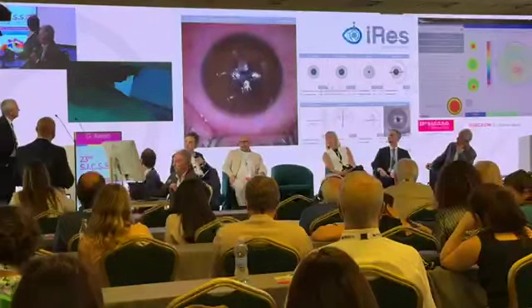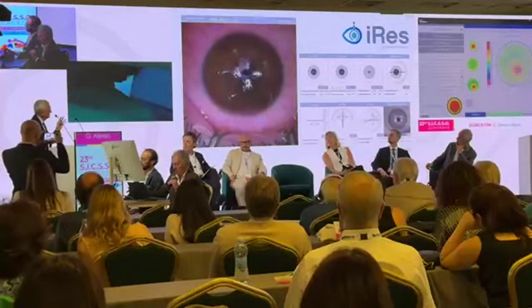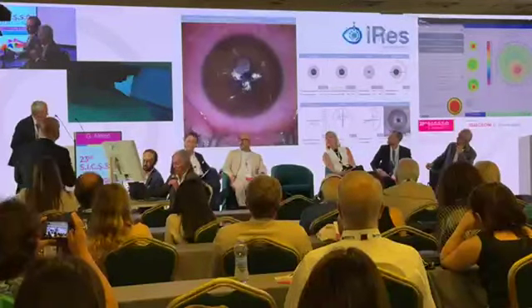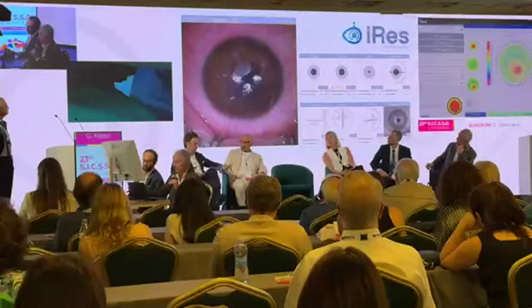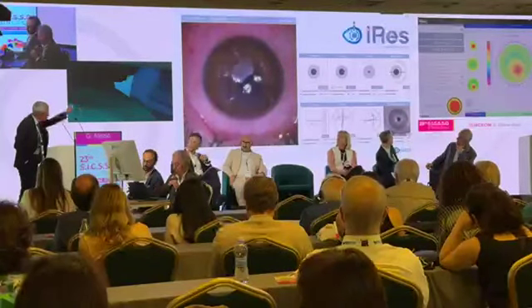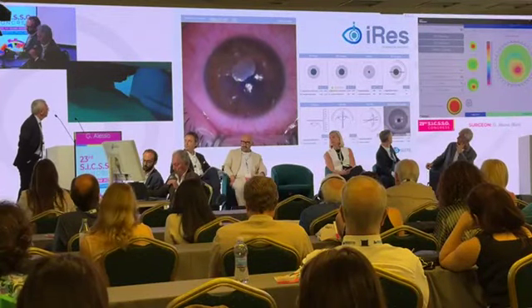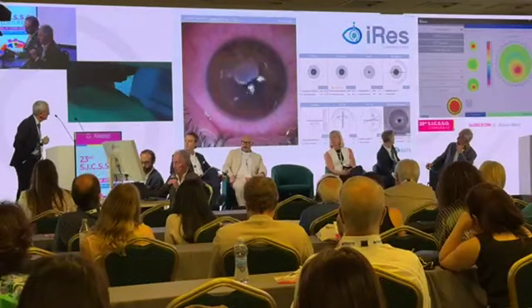How long does the exam take? The treatment takes basically around 60 seconds, from 50 to 60 seconds, the whole treatment, removing epithelium and stroma. 35 seconds remaining. You clearly see the customized ablation, it's of course reversed, but on the top right you can see it. And can you actually talk to the patient as well and tell them, please hold still, don't move? Of course, the laser gives information, it's voice driven, the patient is voice driven.